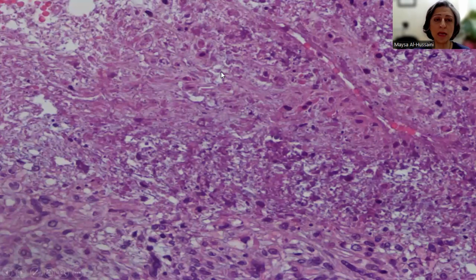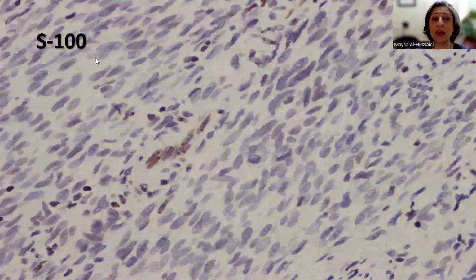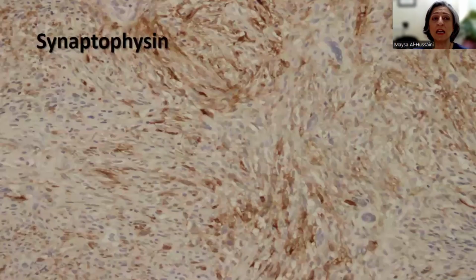Now, put together, in addition to the location, this would really give malignant peripheral nerve sheath tumor number one in the differential diagnosis, but of course we have to rule out other spindle cell sarcomas. Now, thinking along the lines of MPNST, we first perform S100, and we know that S100 immunohistochemical stain at best shows focal weak nuclear staining in terms of immunoreactivity in MPNST. And because of that, the S100 utility in the malignant peripheral nerve sheath tumor is really limited.